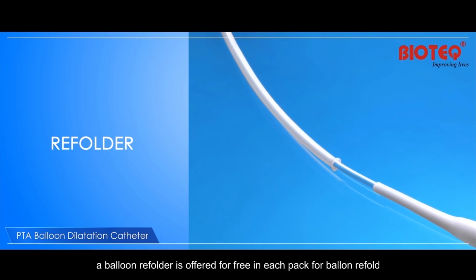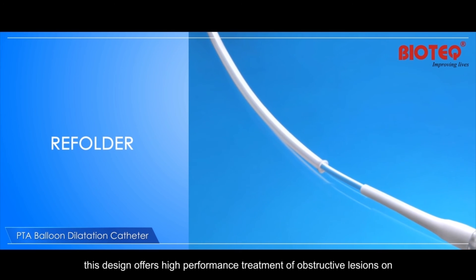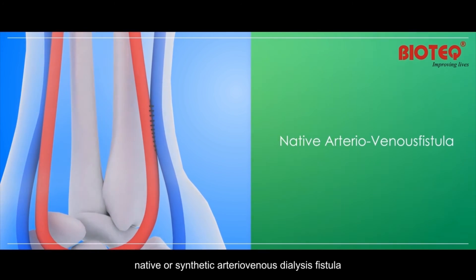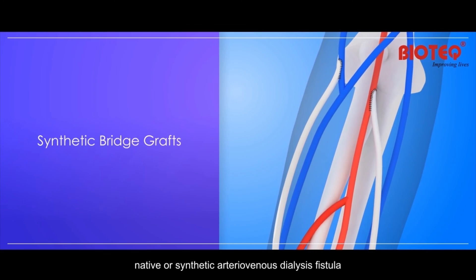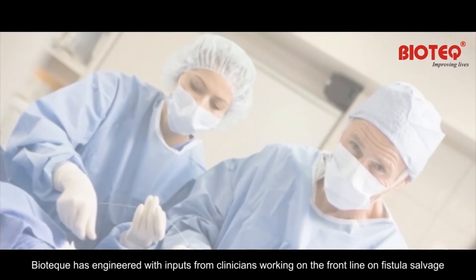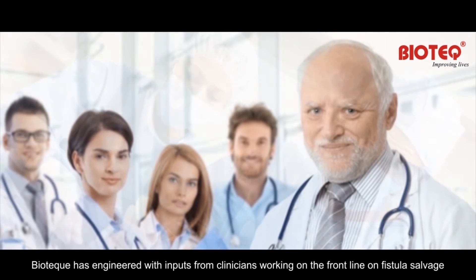A balloon refolder is offered for free in each pack for balloon refold. This design offers high-performance treatment of obstructive lesions on native or synthetic arteriovenous dialysis fistula. Bioteque has engineered this with input from clinicians working on the front line on fistula salvage.